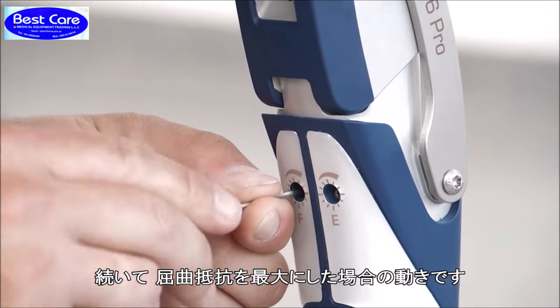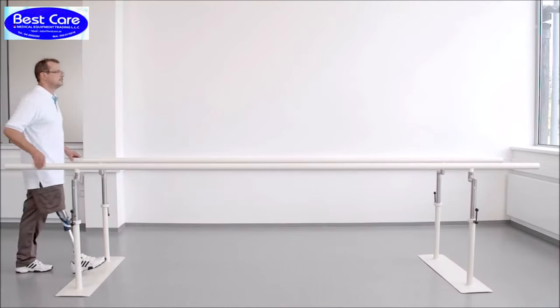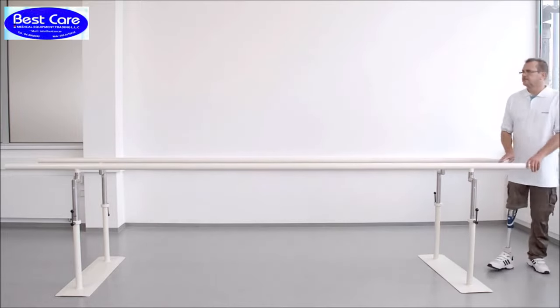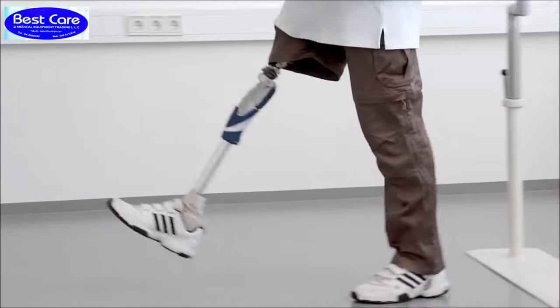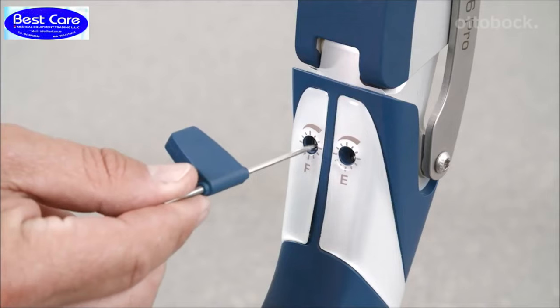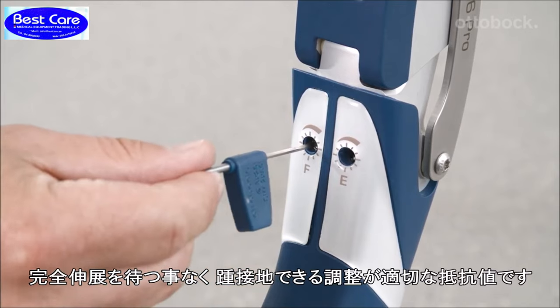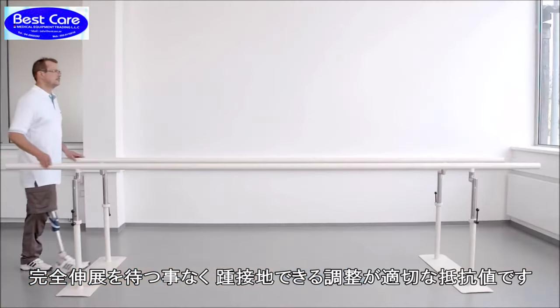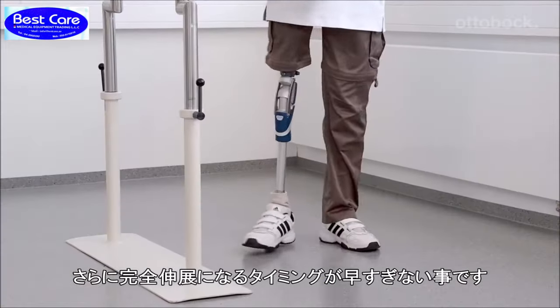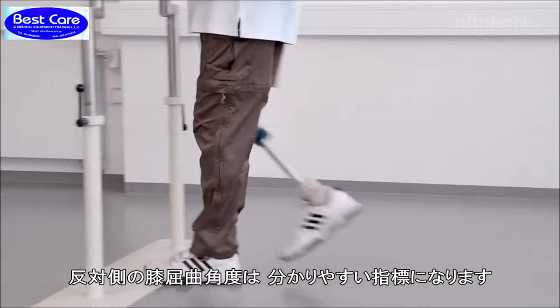At this point, the flexion damping is shown at its maximum. Please reduce the flexion damping a bit. The optimal setting of the damping is reached when the user doesn't have to wait for the prosthesis to reach full extension at heel strike, and the prosthesis doesn't reach its full extension too early. The knee flexion angle of the contralateral side provides a good orientation.